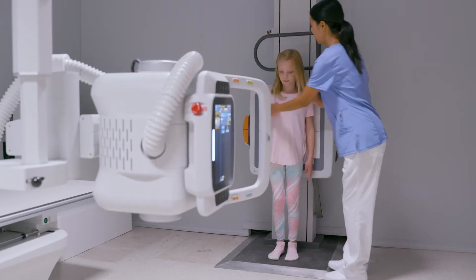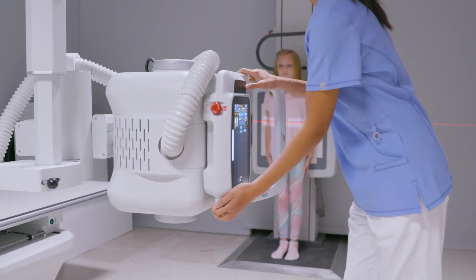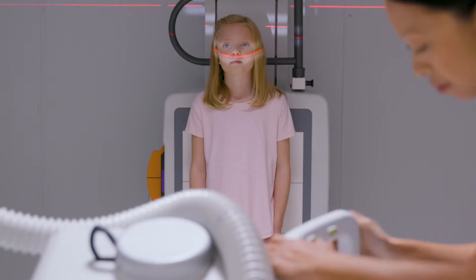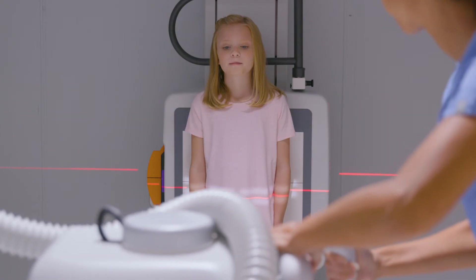Our daughter was diagnosed with scoliosis and has difficulty standing for any length of time. She really didn't like getting x-ray exams because it meant standing still for multiple images. Our pediatrician told us about an imaging center that has a new x-ray system that does auto-LLI imaging, which speeds up the process and reduces the time my daughter needs to hold still. Just like any parent, I want what's best for my daughter, and with a quicker exam, I was less anxious too.